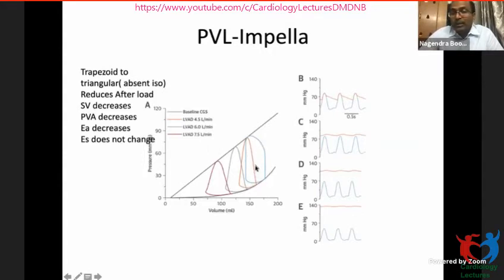The isovolumic relaxation phase and the isovolumic contraction phase have been taken out because, as I told earlier, the blood is getting completely pumped into the aorta, irrespective of cardiac systole or diastole. And if you go from a 4.5 L VAD support to a 7.5 VAD support, the curve which was big like this here is dropped down here, and smaller.